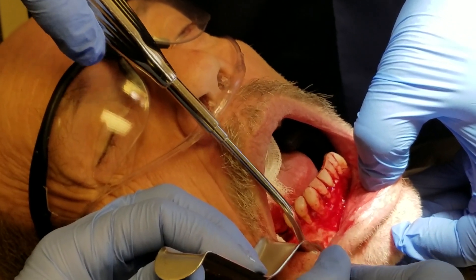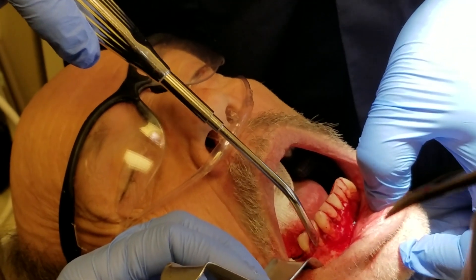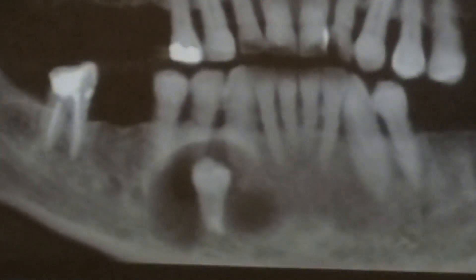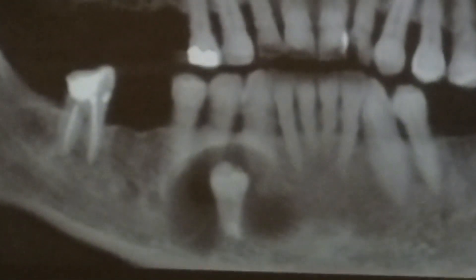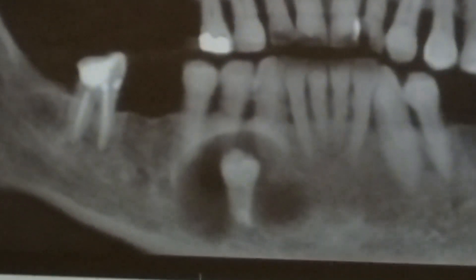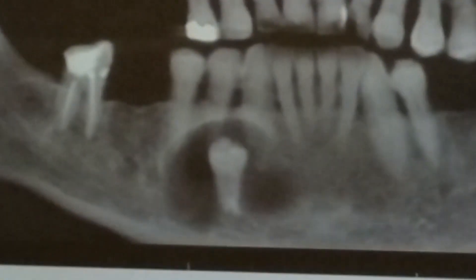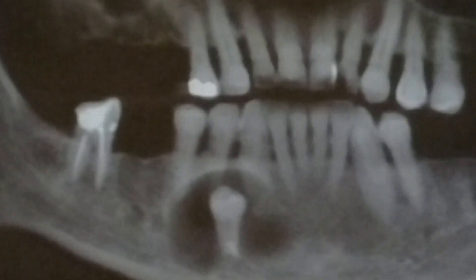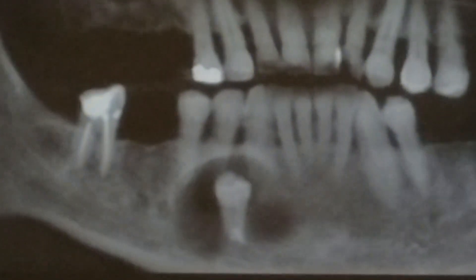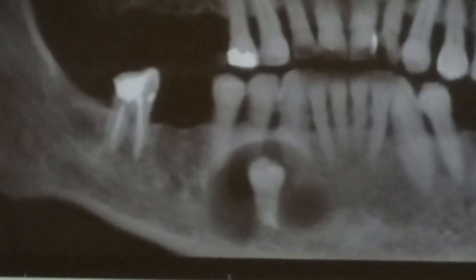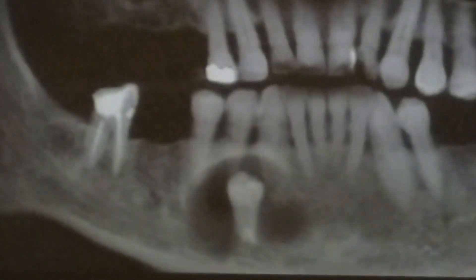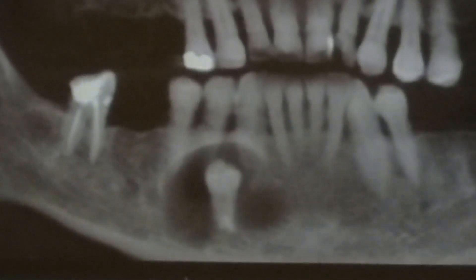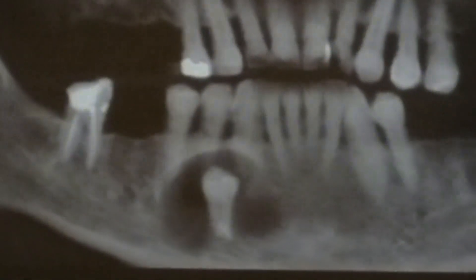What we're going to do next is make a window and clean out the cyst that you can see on the radiograph. There's the impacted supernumerary tooth 28S with that radiolucency around it — all of that is coming out. The next step is to remove a small amount of bone, aspirate to make sure it's not vascular, then remove the rest of the bony window and enucleate the cyst and take out the tooth. We'll come back to show you what it looks like after the bone has been removed and aspirated, but before the cyst or tooth are out.